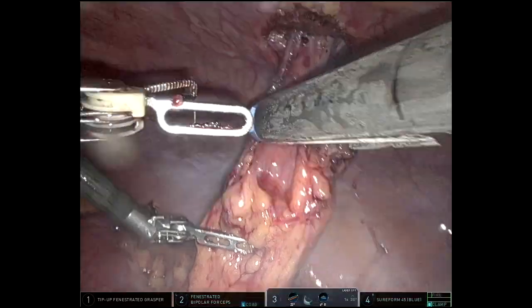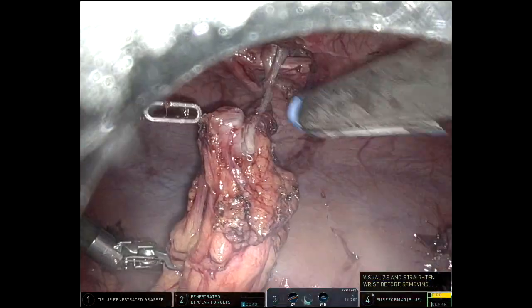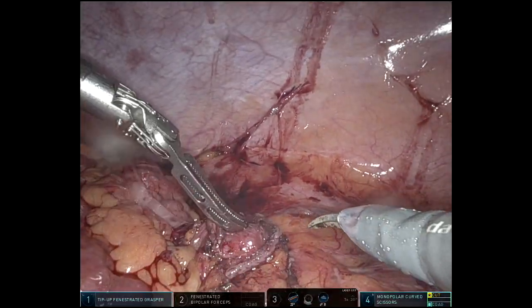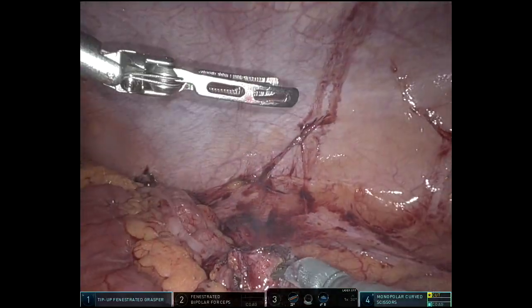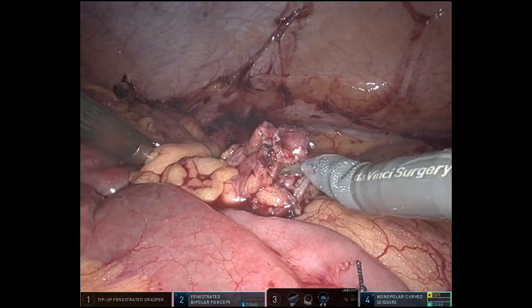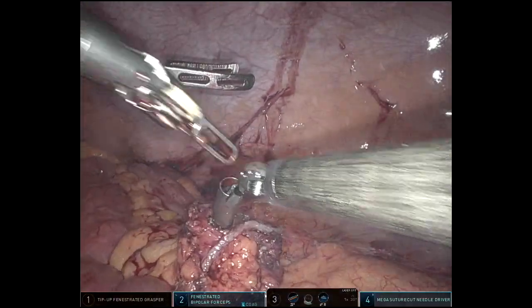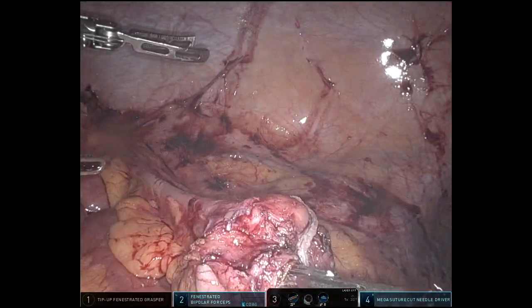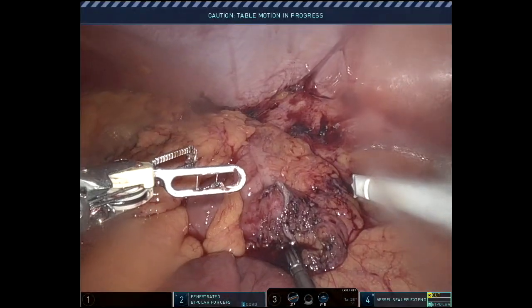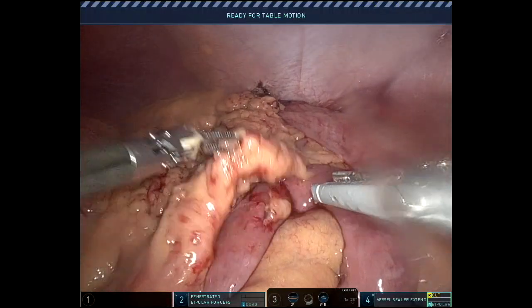Coming in with a blue load, we'll transect the colon right at the level of the fascia. I've done this a few times by leaving the plastic spike on the end of the anvil and attaching a suture to it — you can sometimes see the suture after transection and pull that spike up to the staple line and buzz through. But I found that's not always successful; the suture would exit the staple line off to the side a couple of times. So I don't use the spike anymore. I just drop the anvil in, make a colotomy right in the middle of the descending colon at the level of the staple line, and then push the anvil through — that's worked very easily.